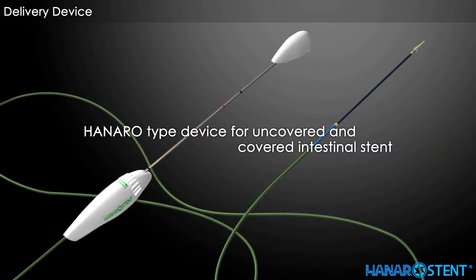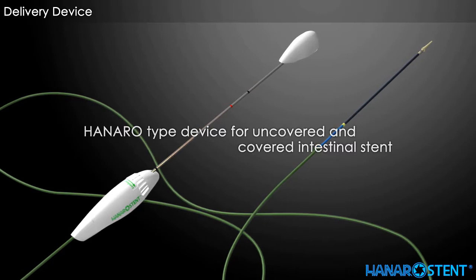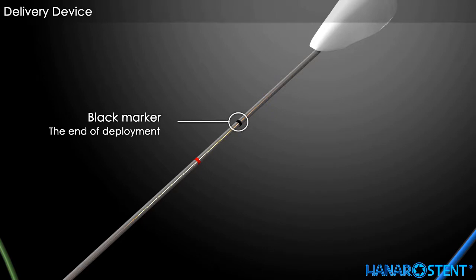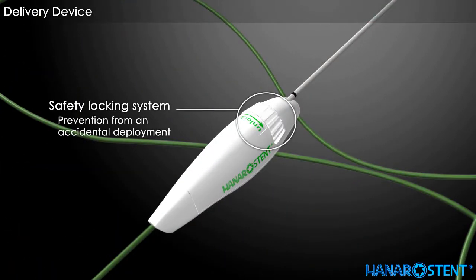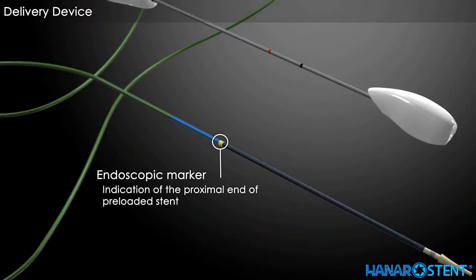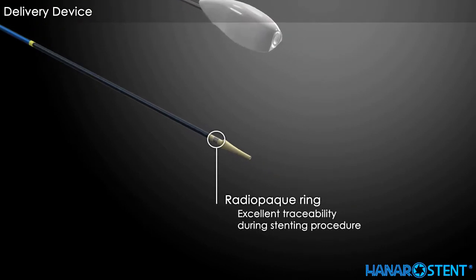This is a Hanaro type delivery device for the Hanaro uncovered colorectal stent. A black marker on the delivery device indicates full deployment of the stent. A red marker indicates the recapturing limit, or point of no return. The locking system prevents accidental deployment during placement. A yellow marker indicates the proximal end of the preloaded stent. A radiopaque ring aids excellent awareness of the deployment procedure through fluoroscopy.